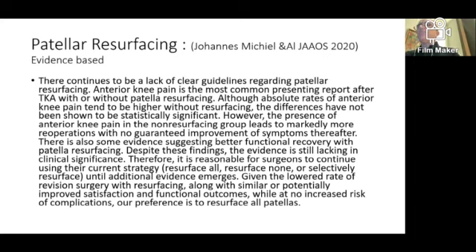Anterior knee pain is the most common complaint reported after total knee arthroplasty, with or without patellar resurfacing. Although the absolute rate of knee pain tends to be higher without resurfacing, the difference has not been shown to be statistically significant. However, the presence of anterior pain in the non-resurfacing group leads to more reoperations, with non-guaranteed improvement in the symptoms. Thus, there is some evidence suggesting better functional recovery with patellar resurfacing. Despite this finding, the evidence is still lacking till 2020, and surgeons continue to use their current strategy.